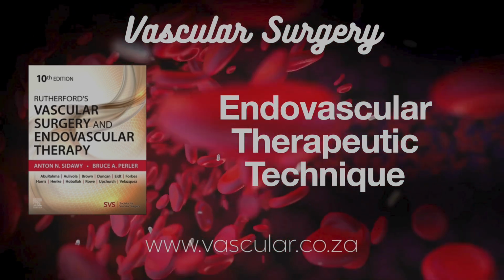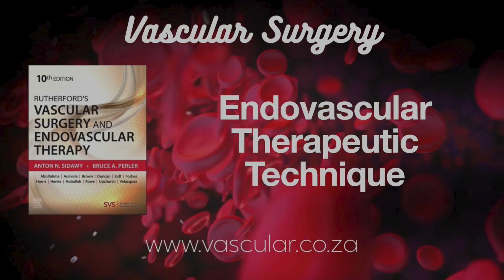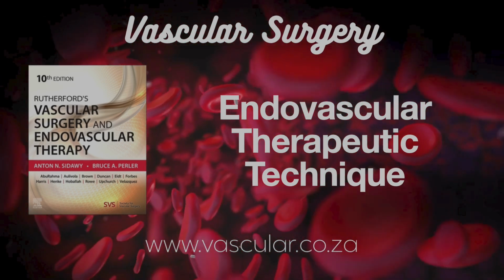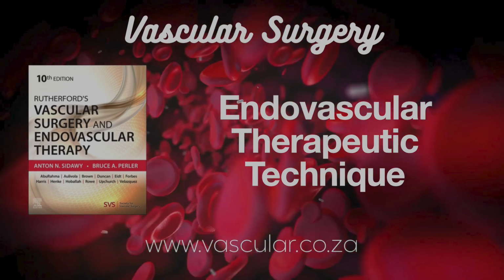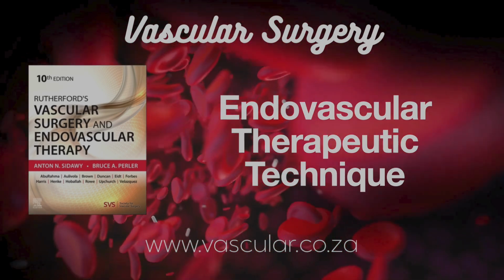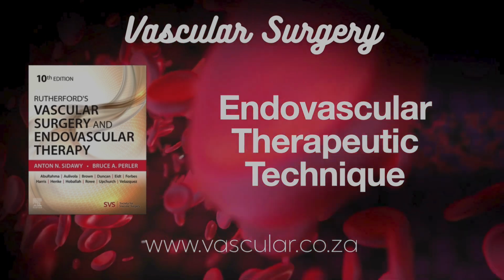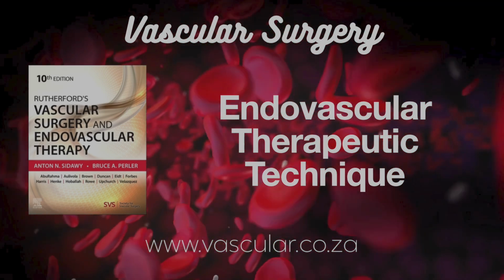Can involve predilation with an undersized balloon, using scoring or cutting balloons, or atherectomy. Especially needed before DCBs. Often, yes, to ensure good drug transfer. Atherectomy debulks plaque. The Definitive AR trial suggested atherectomy plus DCB might be better than DCB alone in long calcified lesions if prep is effective. The Superb trial with the Supera stent also stressed optimal prep for good deployment.